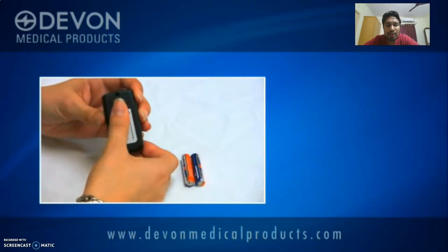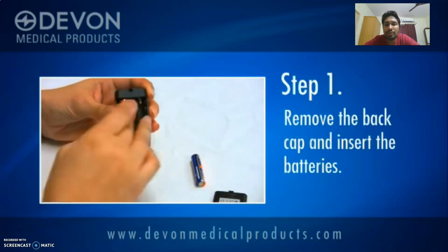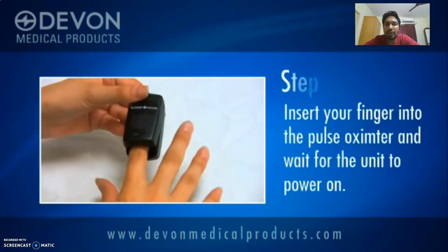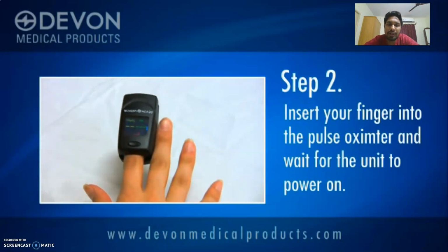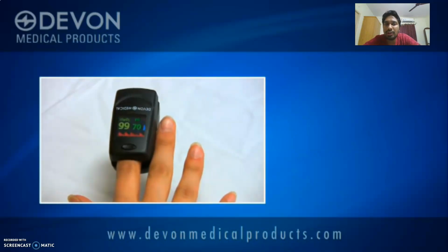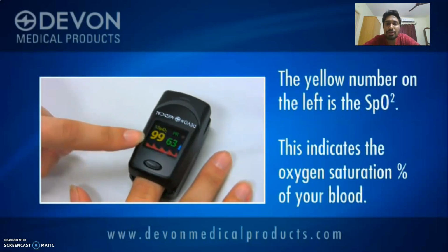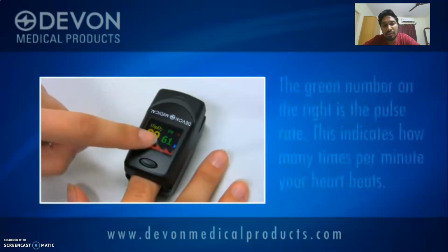How this actually works out is a very simple procedure. Once the product is developed, you need to put in your battery. That battery powers the unit, and from that you can get your pulse rate. And once it is done, you are supposed to place your finger in the product so that it calculates some vital parameters. The first, yellow one shows the SpO2. It shows a value of 99%, so it's normal.